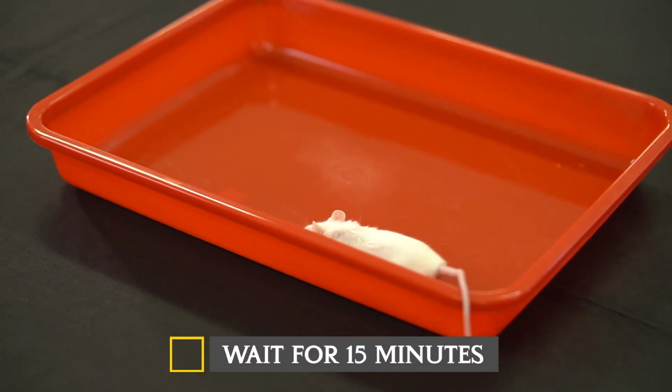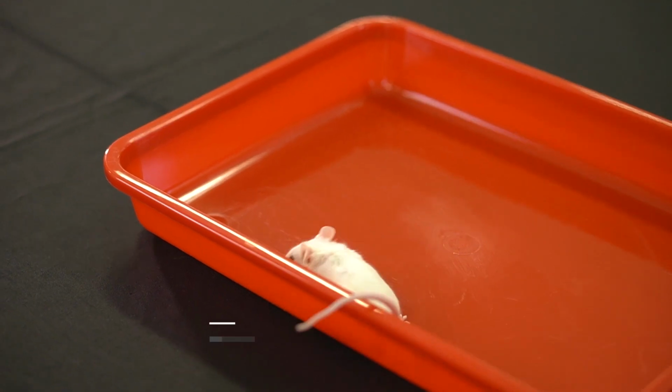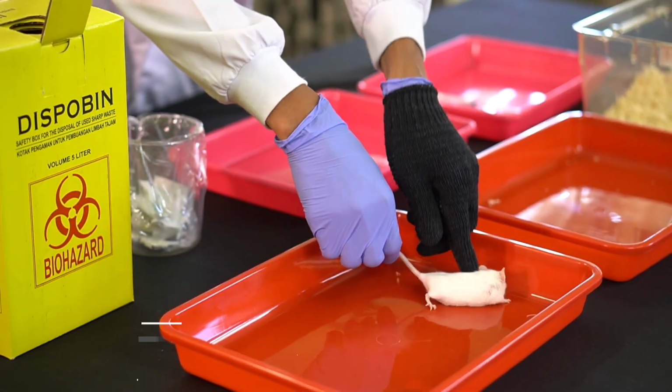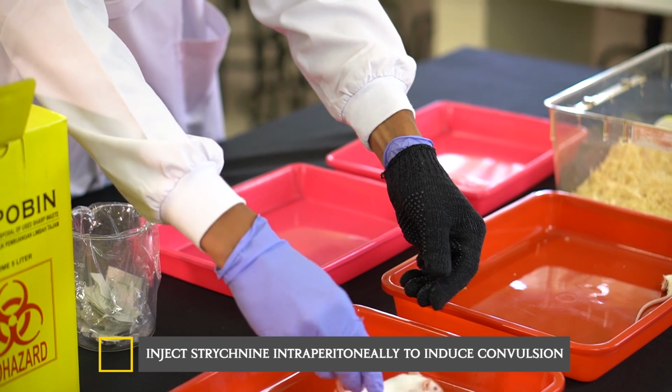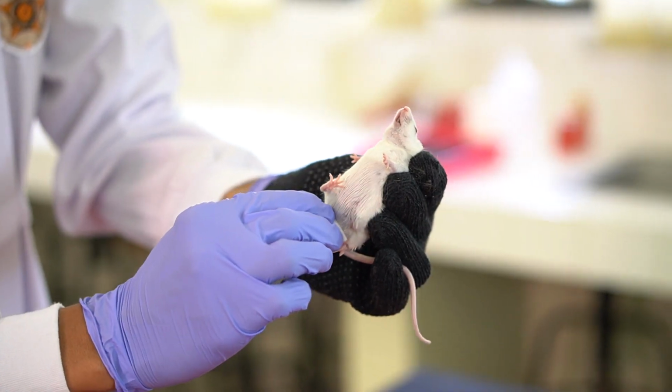Wait for 15 minutes. After 15 minutes, inject the strychnine intraperitoneally to induce convulsion.